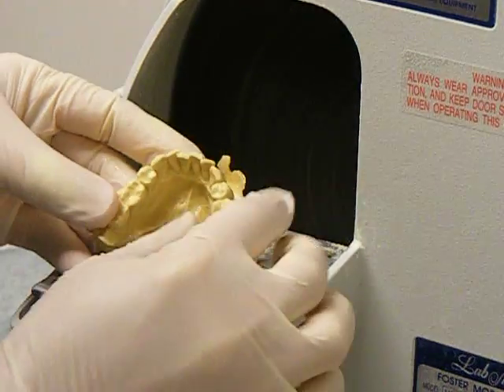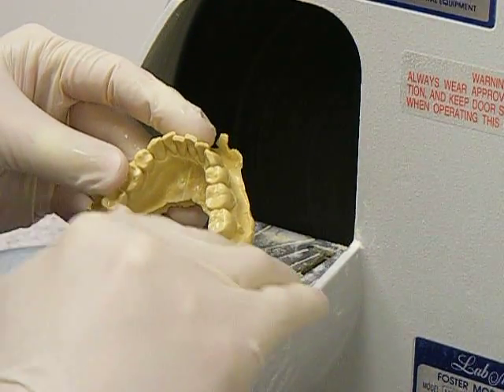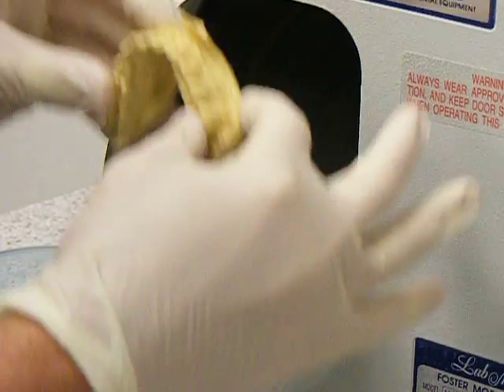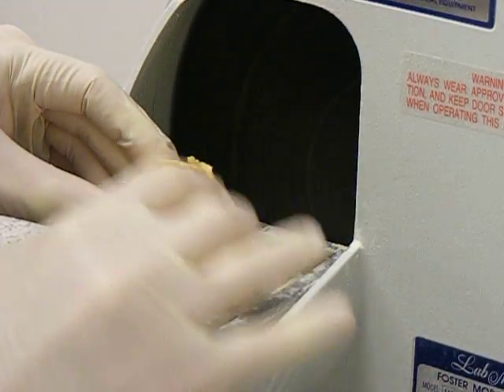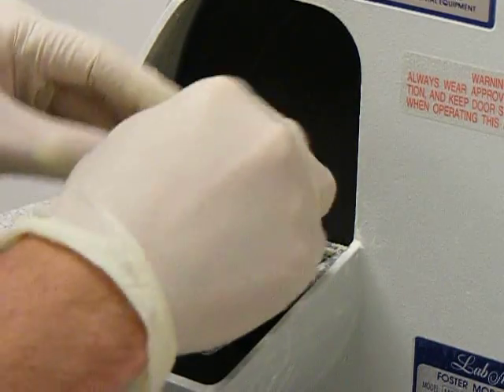Make sure that your model has been soaked in water. The first thing we're going to do is trim the back portion, or the heels of the model, and then stand it up on this table and make sure that it is straight, so that everything else that we trim is straight along with it.